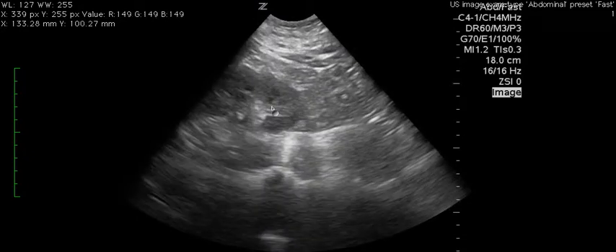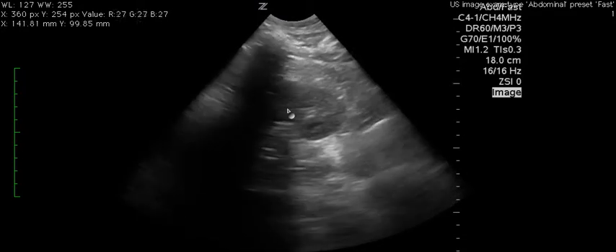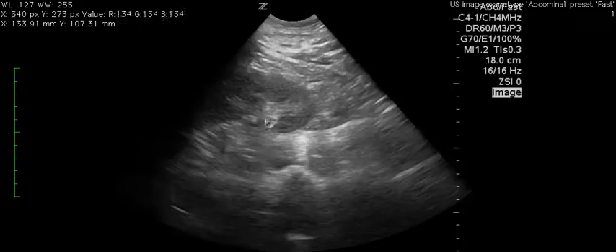This is a FAST exam. This is the left upper quadrant. You can see a good view of the kidney, but you have trouble seeing the spleen.